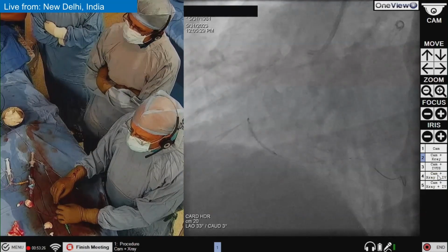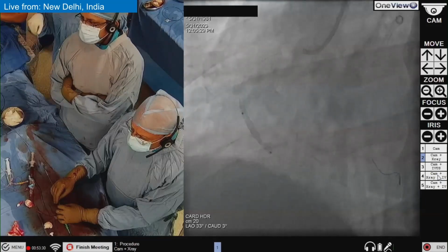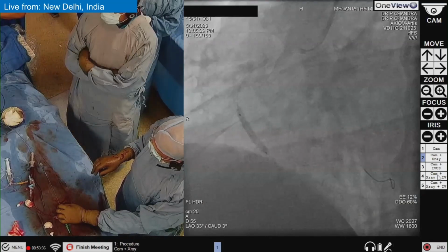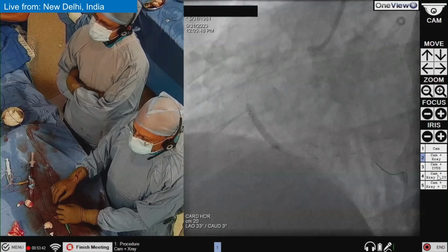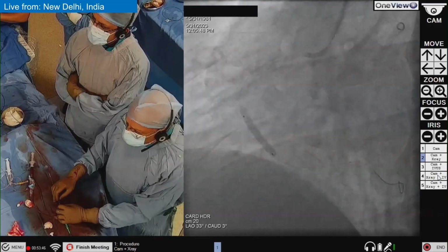Go up, please. 1, 2, 3, 4, 5, 6, 7, 8, 9, 10, 12. So we are exactly located, and 12 is fine. Okay. Deflate.